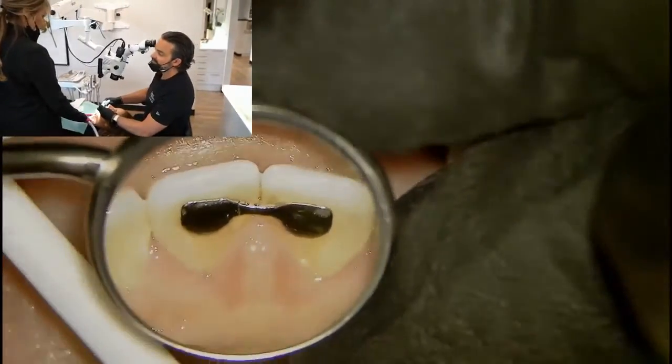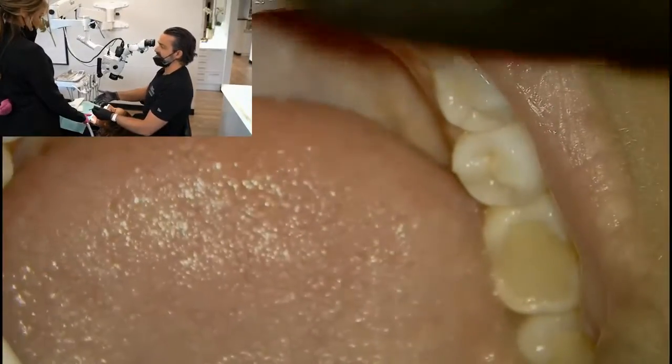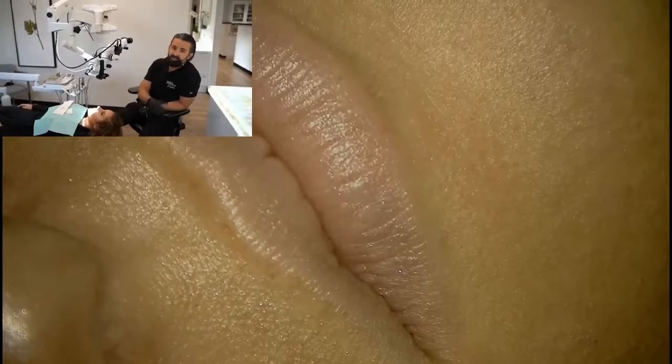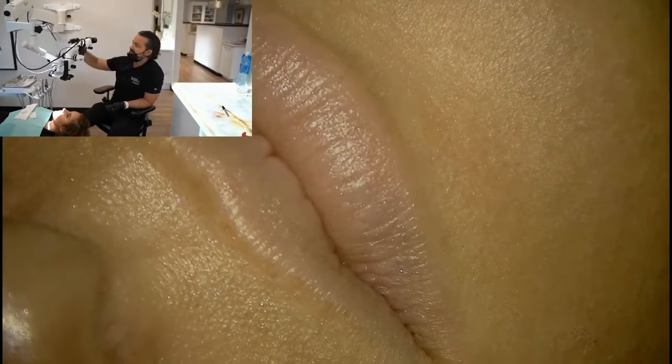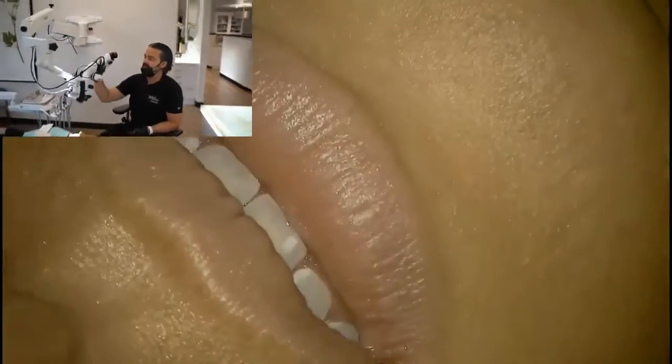And so it gets very comfortable. But I will always work at 12 o'clock because I will have access to the entire mouth like that. Again, the vast majority of people are probably over here, and that's fine if that's what you like. When you do that, you want to identify the features of a microscope that still give you correct posture. So variable focus here, and then angle corrections up here, especially with this eyepiece.